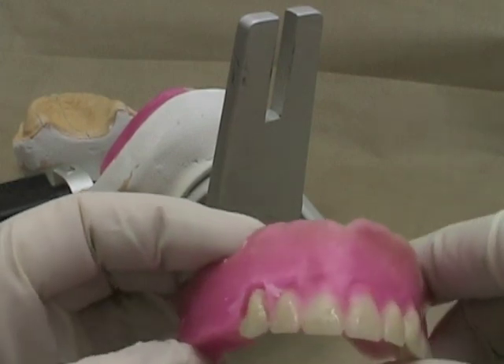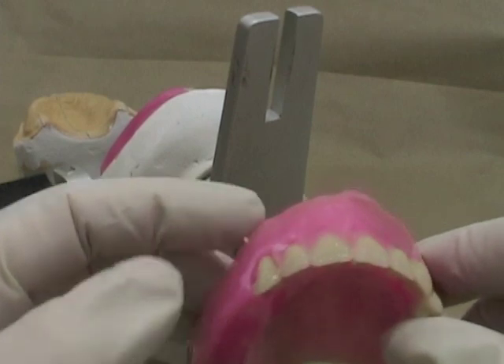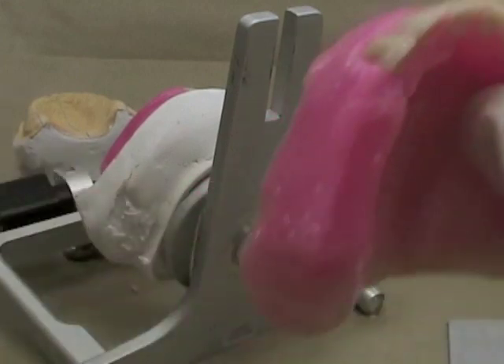Try not to get too much wax on the teeth at this point because we're going to have to clean that off later. It makes it a lot easier to move and set teeth if there's not a lot of wax on them.